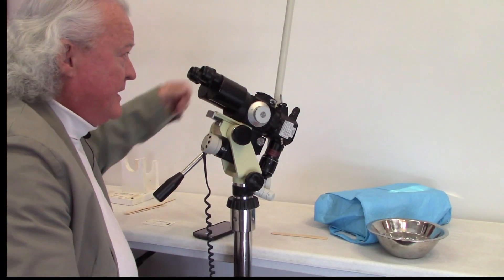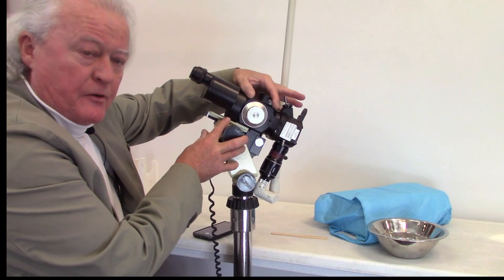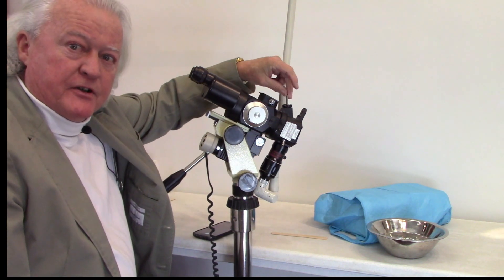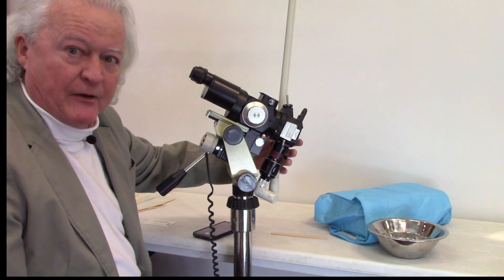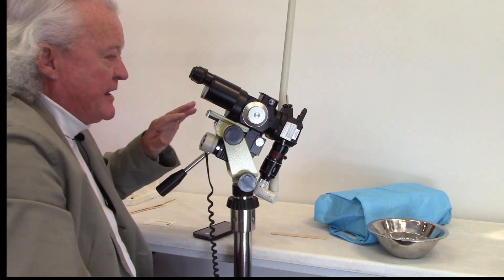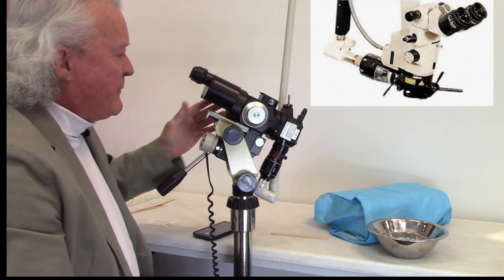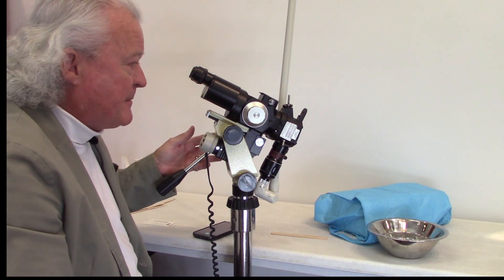We now have the laser arm hooked up to the micro manipulator on the scope. Because I'm using a colposcope in this setup, I have to be able to reach the joystick at the top, so the manipulator is actually mounted upside down with the laser beam coming in from the bottom and going up through it. There are other configurations — with a surgical laser it's usually mounted in the horizontal configuration. What we want to do now is some test shots to set up our spot size.